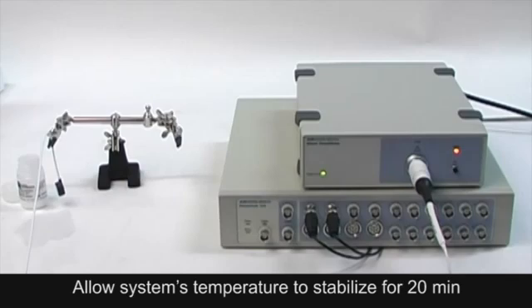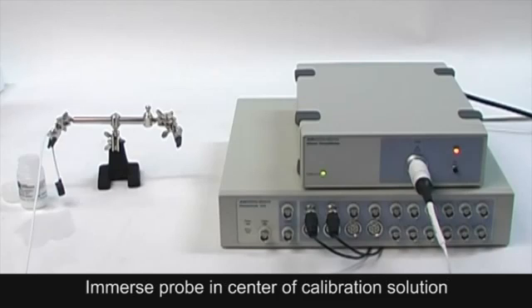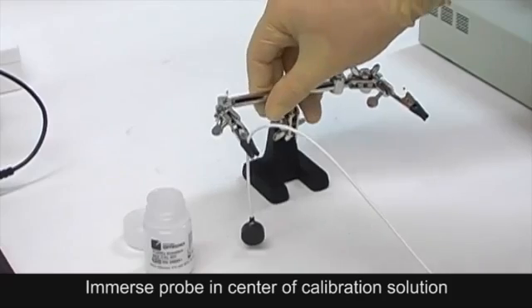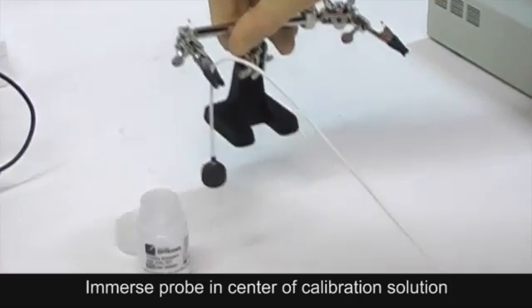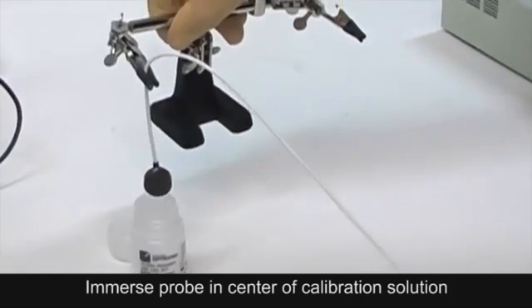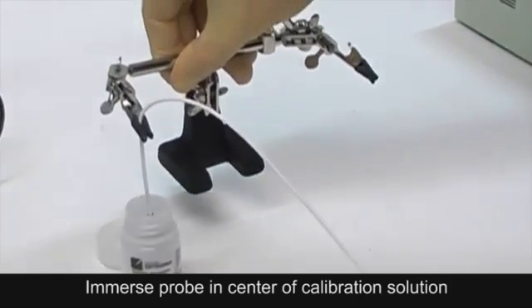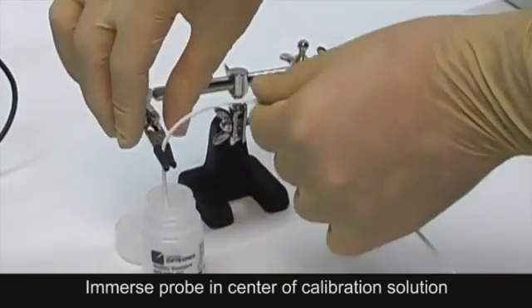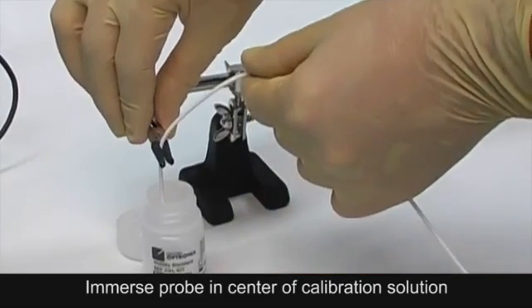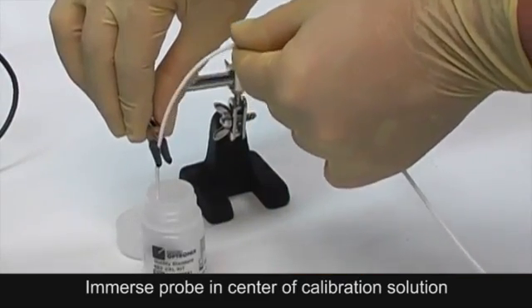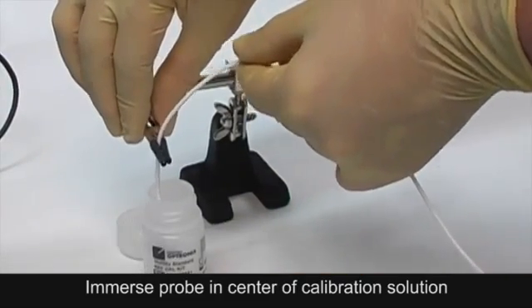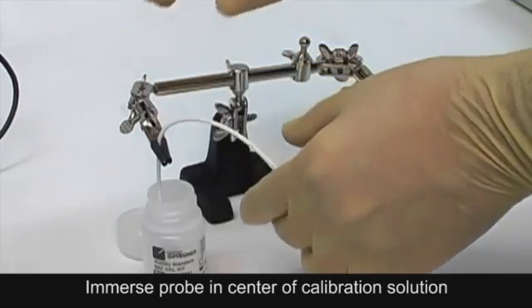Allow the system's temperature to stabilize for at least 20 minutes prior to performing the calibration. Use the positioning stand supplied with the calibration kit to position the probe at the centre of the calibration suspension, whereby the surface or tip of the probe is equally distant from all sides of the vessel.